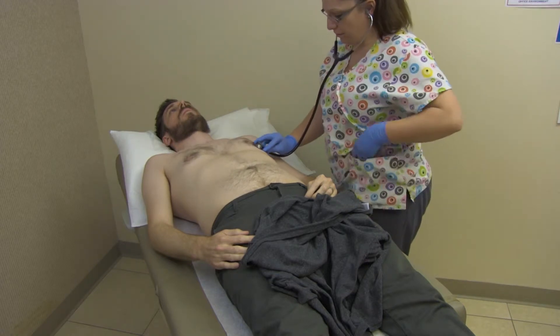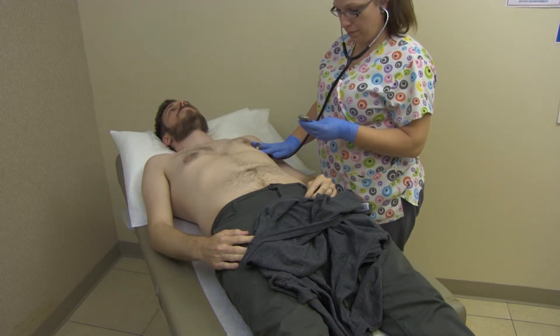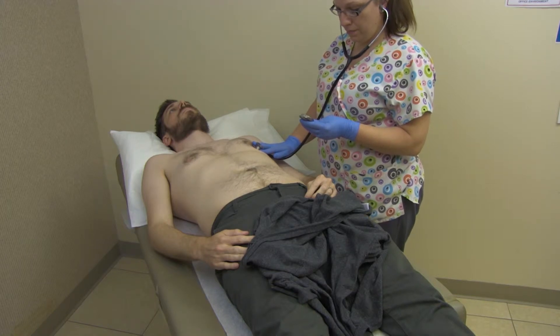Place the bell of the stethoscope on that site and listen for the lub-dub sound of the heart. Count the pulse for 60 seconds. Each lub-dub equals one beat.